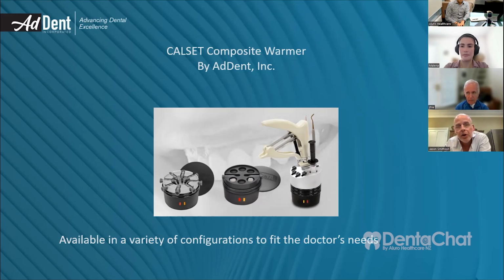So if you imagine sculpting it with a cold, room temperature instrument, you're losing heat via conduction, which you're not so much with this bit of kit. So when you're talking about temperatures, you've got to compare apples with apples, and compare similar heaters, because a heater with just a flat pad is not going to be the same deal as this. In my opinion, you could probably get away with heating the resin less with this in comparison with a flat plate heater, because you're going to lose a lot less via conduction and convection. I don't know if you've got any input on that, Josh.